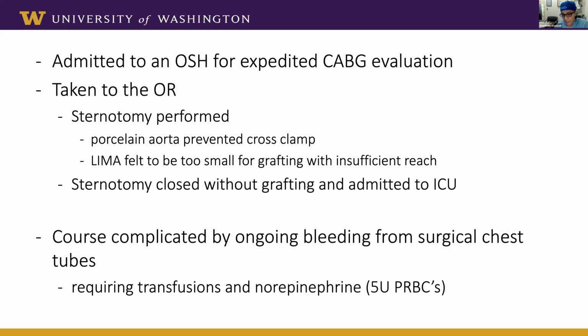So there is a knee-jerk reflex with a patient like this, a patient with three vessel disease or left main. In fact, the left main is no longer a merely surgical disease, unless you're talking about the distal left main. This could be called a sort of distal left main, but it's still actually at 79, a patient who has a huge circ, a huge LAD, where you can put 4 or 5 millimeter stents. I'm not sure this should be an automatic referral to surgery.